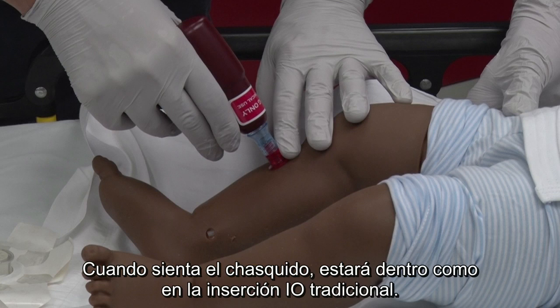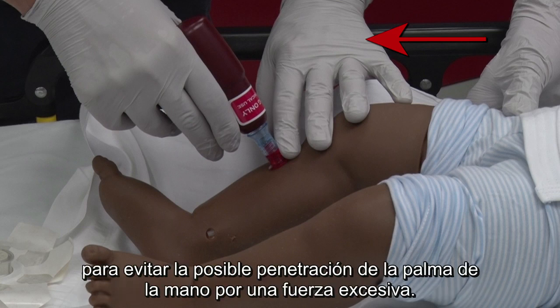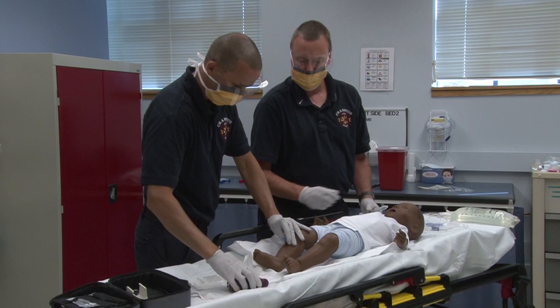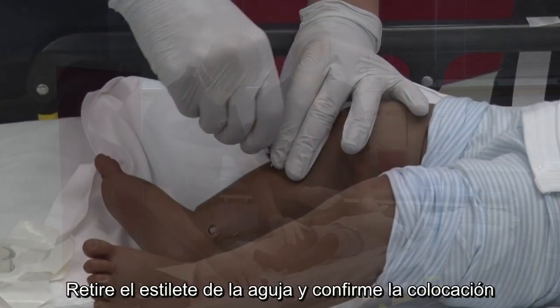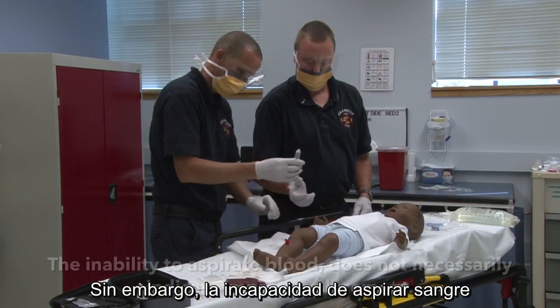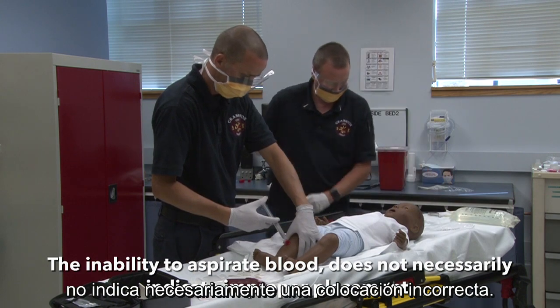As with traditional IO insertion, refrain from placing your other hand behind the insertion site to prevent possible palm penetration from excessive force. Disconnect the Easy IO drill while leaving the needle in place. It should simply pull off as it is a magnet. Withdraw the needle stylet and confirm placement by aspirating of blood with the syringe. However, the inability to aspirate blood does not necessarily indicate improper placement.